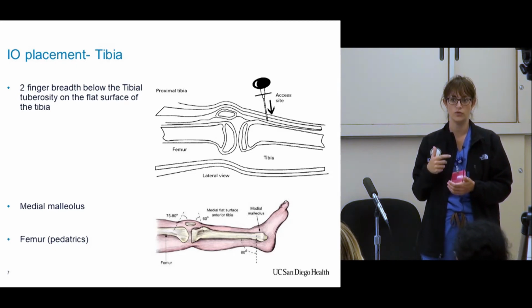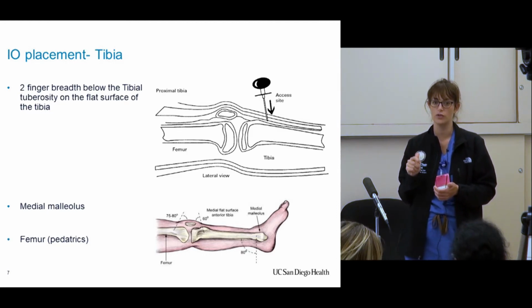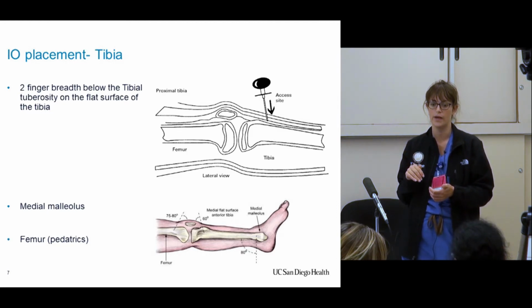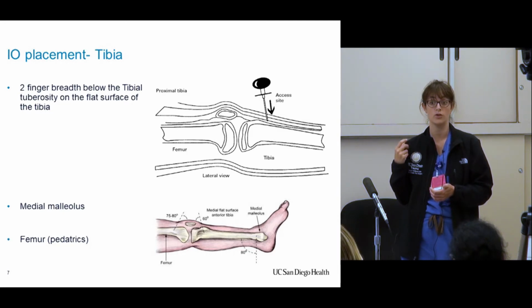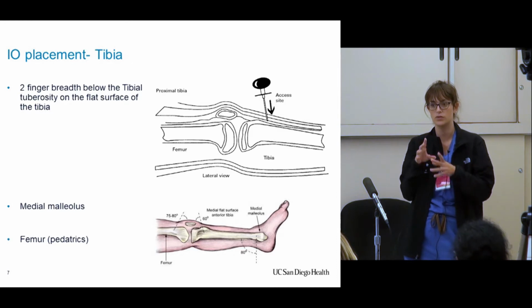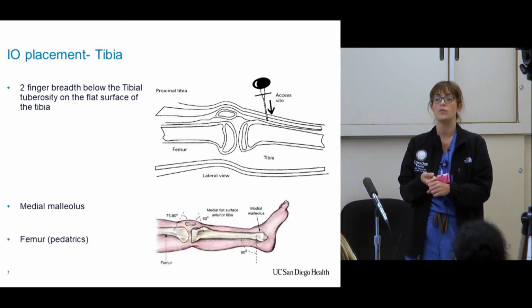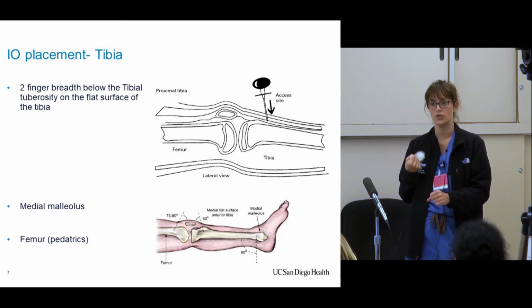That can be painful if you do it fast. If you just apply consistent pressure and do it slowly, it is more comfortable for patients who are awake. But you need to push a considerable amount, 10 cc's, sometimes 20 cc's, to really break it up a little, because there's a lot of fibrous connections inside that you need to break through to get it to flow smoothly. And then when you draw back, go nice and slow on the drawback.